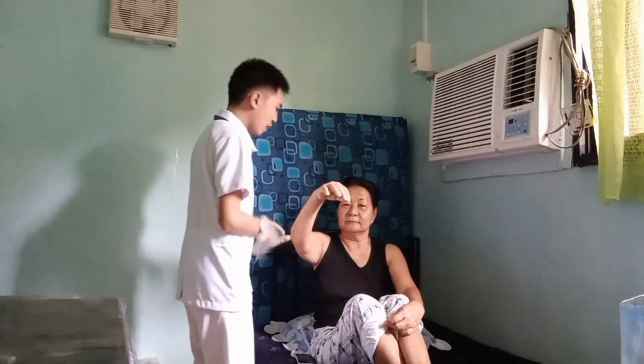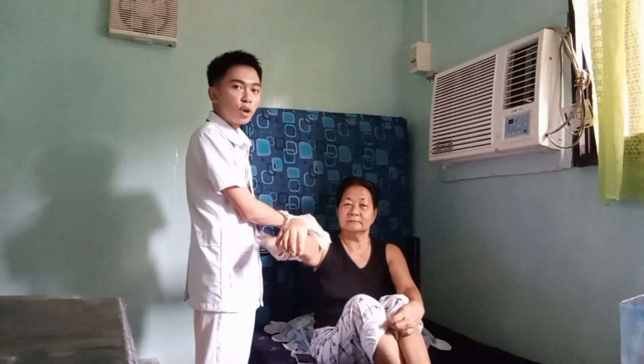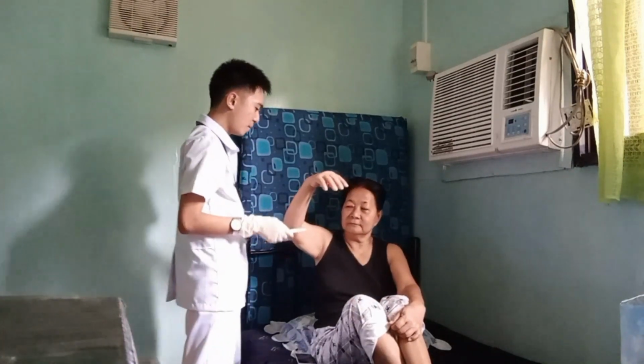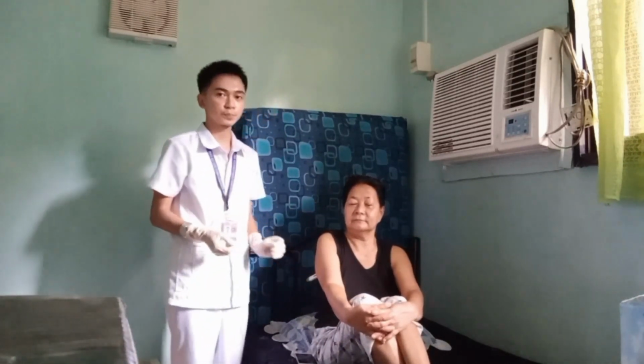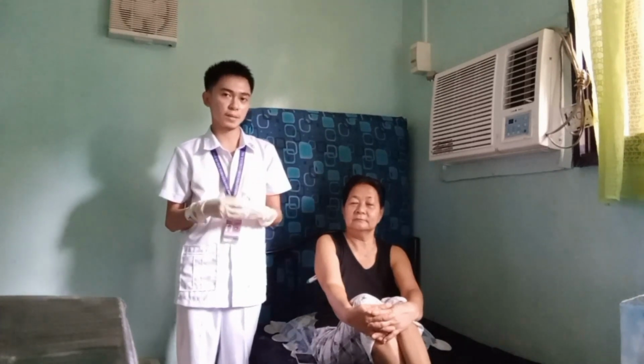Pat the axillary area dry. Okay, thank you, ma'am. So I am going to put this thermometer in your arm, and can you close your arm? And do not forget to turn on the thermometer. So wait for the appropriate amount of time after its placement.